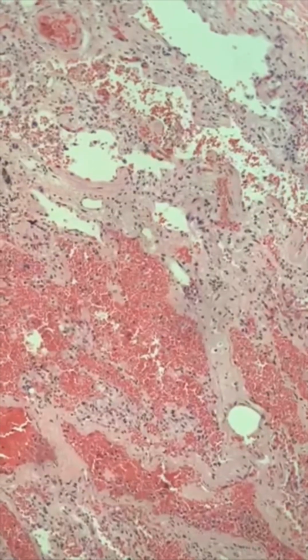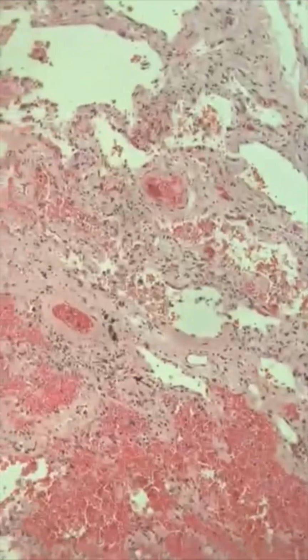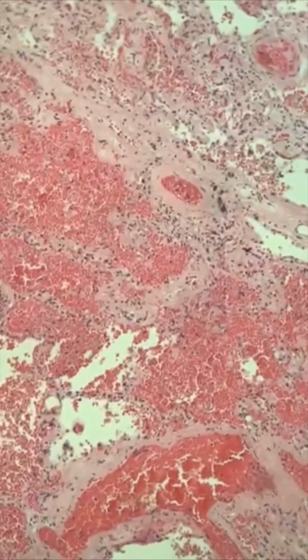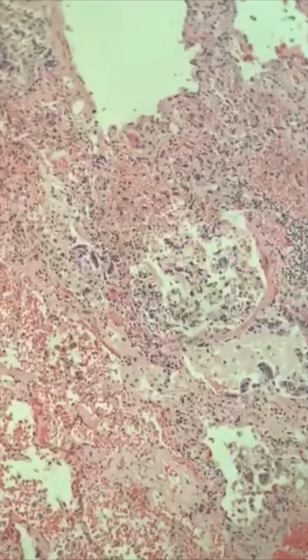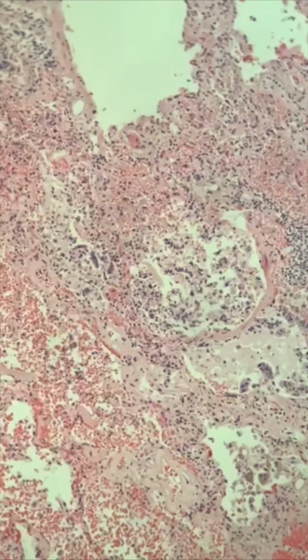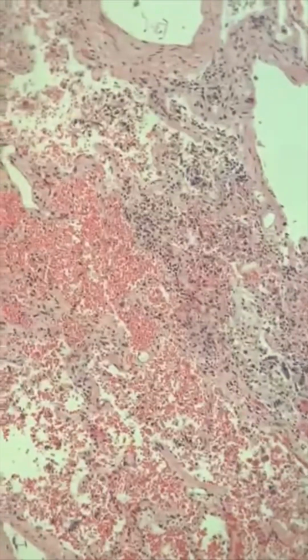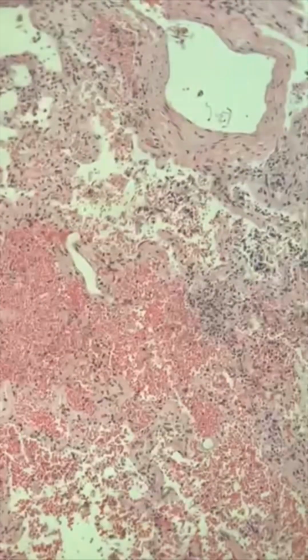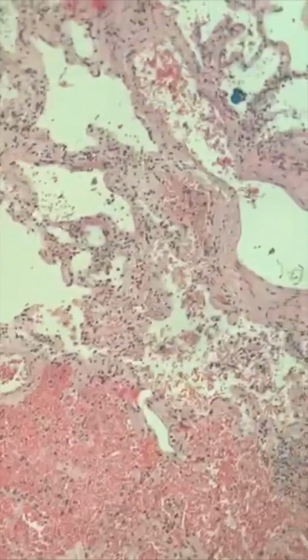You can see that there's evidence of recent hemorrhage around the vascular spaces and the alveolar channels. I'm going to go down to show you, I usually take multiple sections of lung tissue. So you can see some bronchial cells and some alveolar histiocytes, which are normal to see sometimes in a deceased person. This person had been dead for some time, discovered dead a few hours after death, while should be under surveillance of our 24/7 nursing home care.